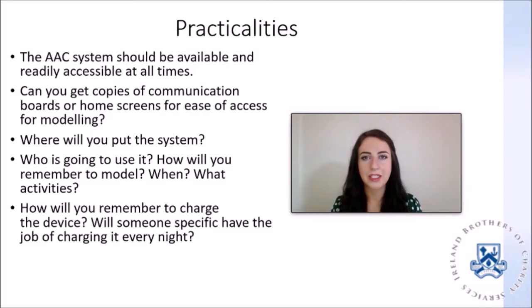How will you remember to charge the device? Will someone specific have the job of charging it every night? This is really important. Devices do need to be charged every night, and they can take a long time to charge. So if we forget to charge it and then we need to charge it in the morning, either the device can't be used for a few hours, or you and the language learner are going to have to sit next to a socket while it charges.